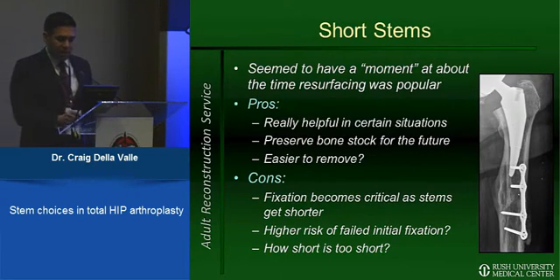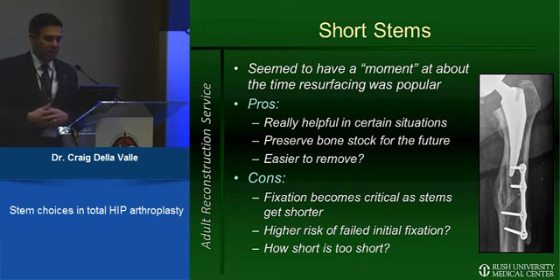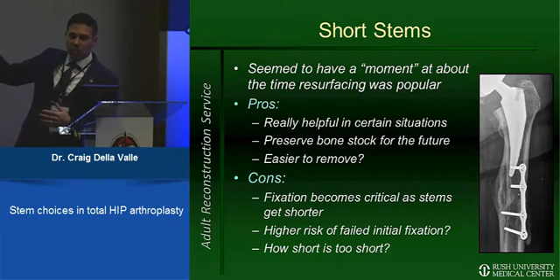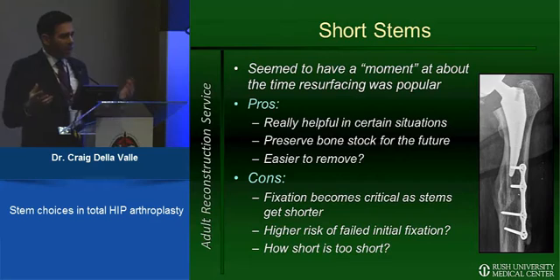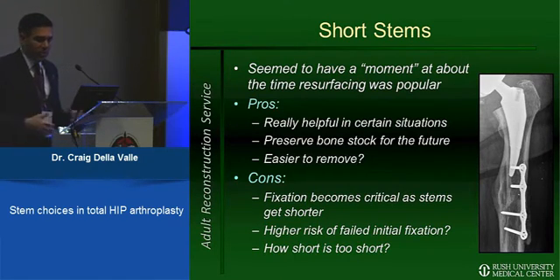The final thing I'm going to touch on is short stems. Short stems, at least in North America, seem to have a moment, so to speak. With the FDA approval of hip resurfacing in the United States, I think people saw this as a conservative option. I think in situations like this where you have retained hardware or a funny deformity of the femur, knowing how to use these stems is a nice tool to have in your pocket.